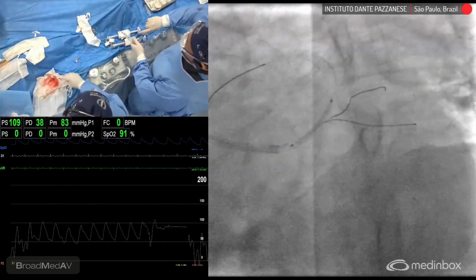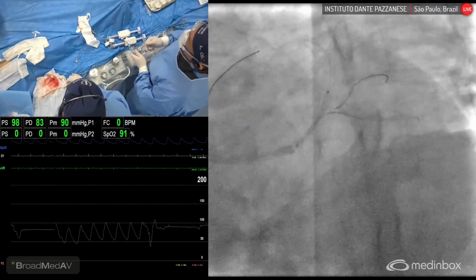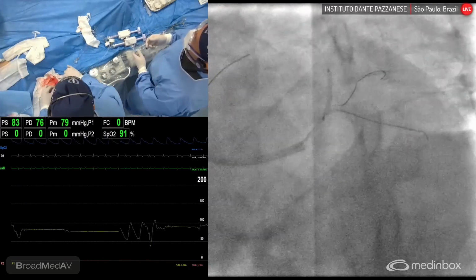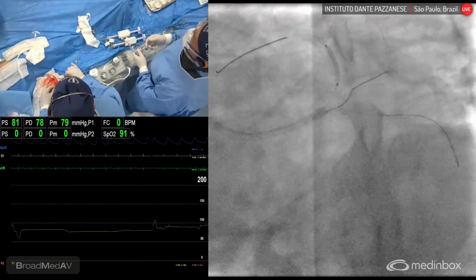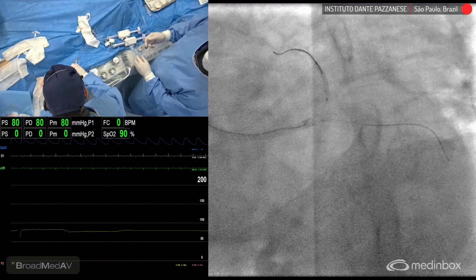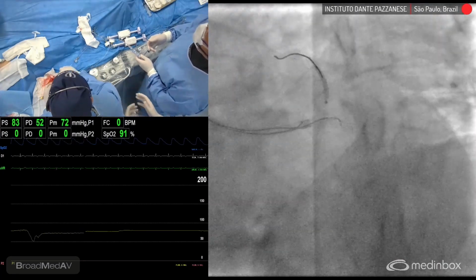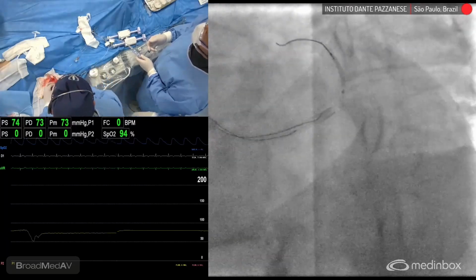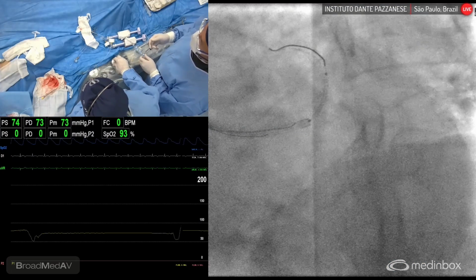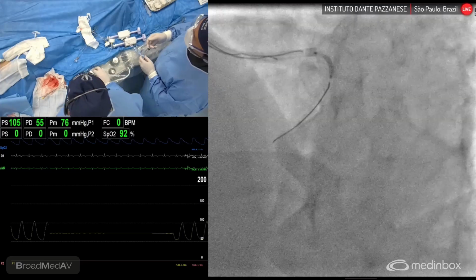Also, it's a good idea to remove the wire from the circumflex, right? Yeah. And we saw how easily the stent was advanced, because of removing the wire. Yes, we did the crush. Exactly. If you were too protruded without the kissing, you could have problems here. So Rodolfo basically removed the wires from the circumflex because you don't want to have wires in between metal, in between stents.